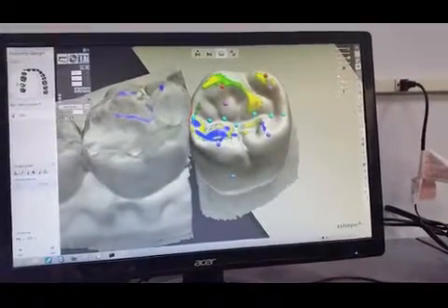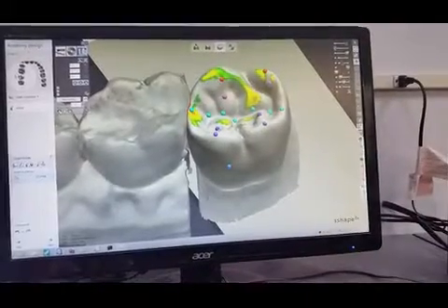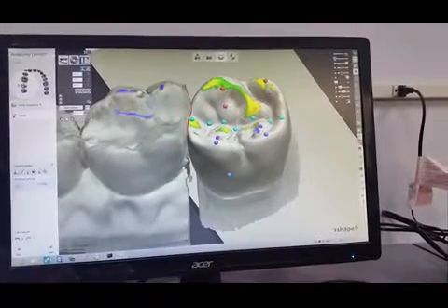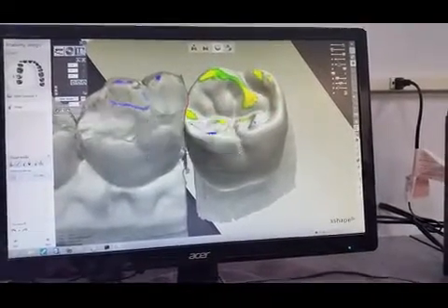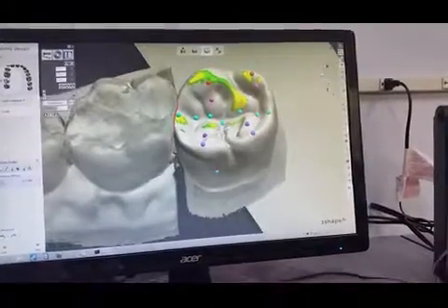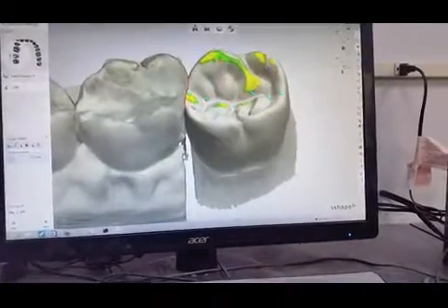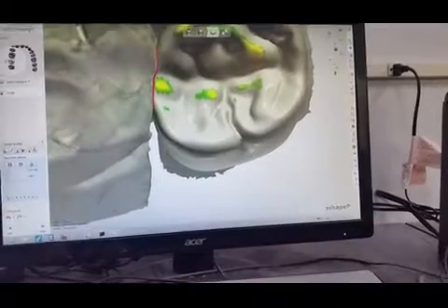Okay, let's bring this down. Yeah, that's very light. Now just barely. And we're not touching anymore. As you can see, we're going into lateral movement and there's no contact anymore. We'll close that and we can smooth where we kind of grind it on the crown a little bit.